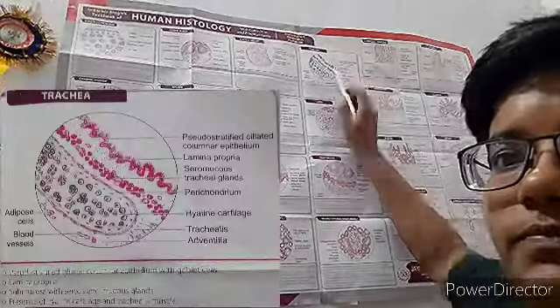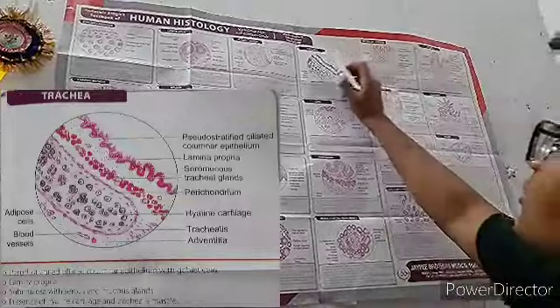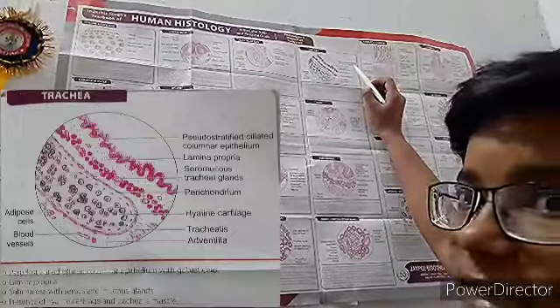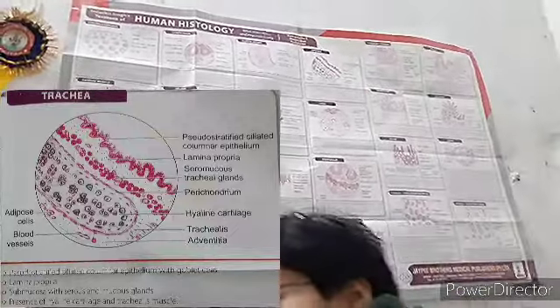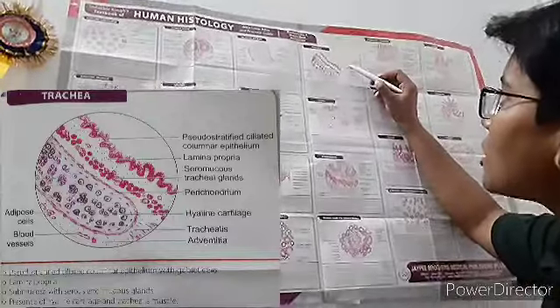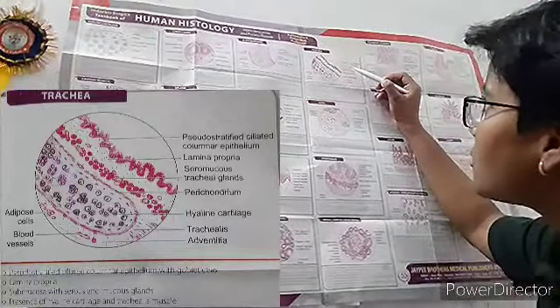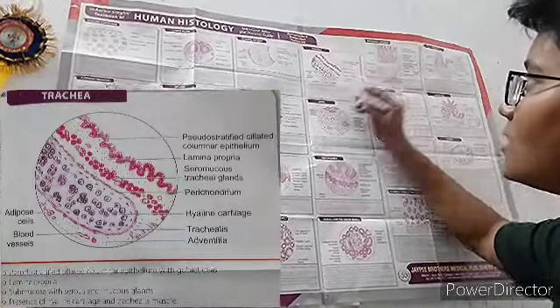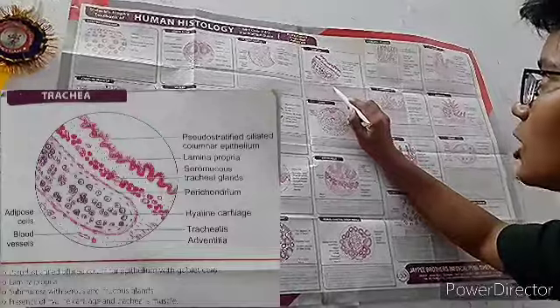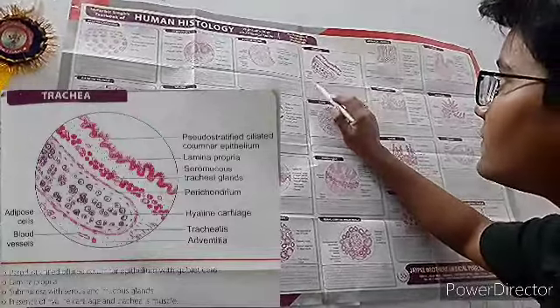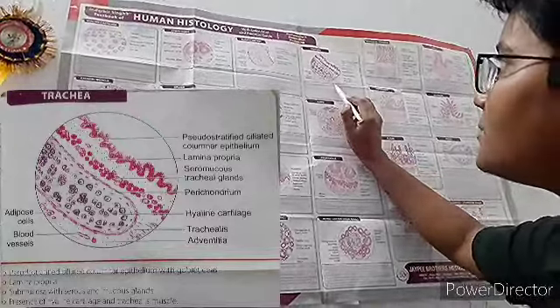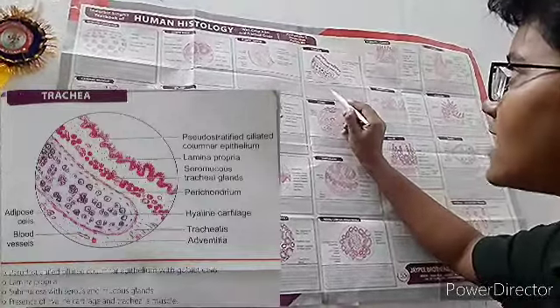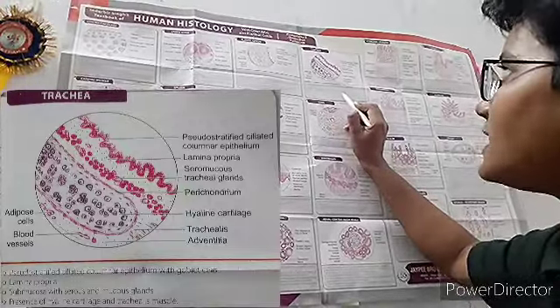Now the trachea. Visible structures include adipose cells, blood vessels, pseudostratified ciliated columnar epithelium, lamina propria, seromucous tracheal glands, perichondrium, hyaline cartilage, and trachealis adventitia. The trachea is lined by pseudostratified ciliated columnar epithelium with goblet cells. The lamina propria and submucosa contain serous and mucous glands. Hyaline cartilage and trachealis muscle are also present.